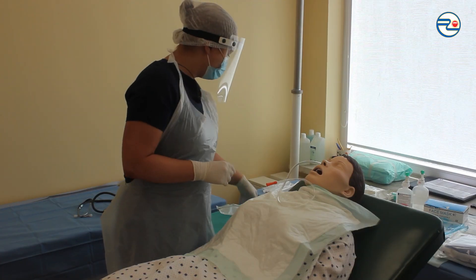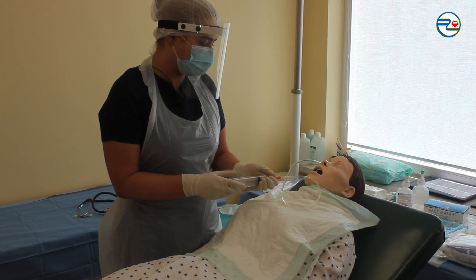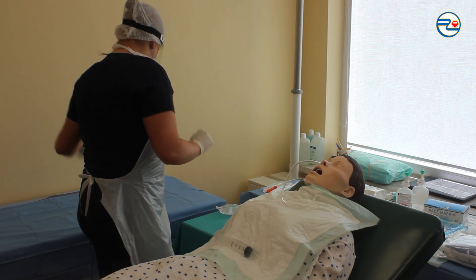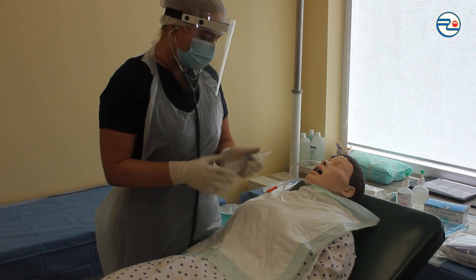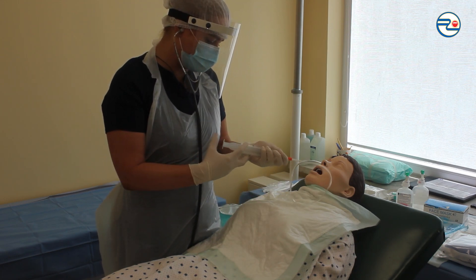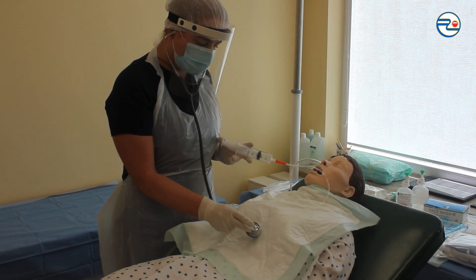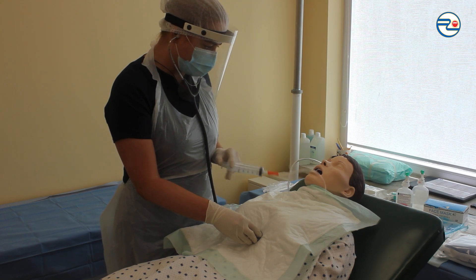Trying to extract some content from the stomach with the 50 ml syringe — no content obtained. Removing the syringe, putting on the stethoscope, drawing some air into the syringe, connecting the syringe to the tube, pushing air through the tube, and listening in the epigastric area for bubbling sounds.